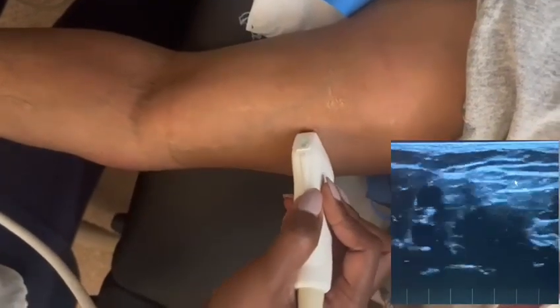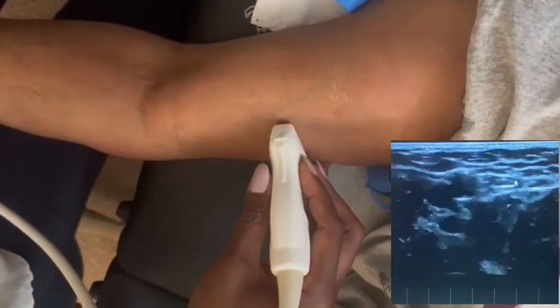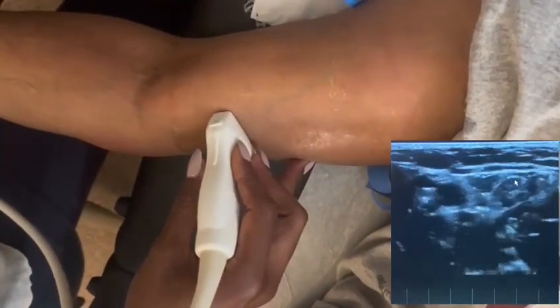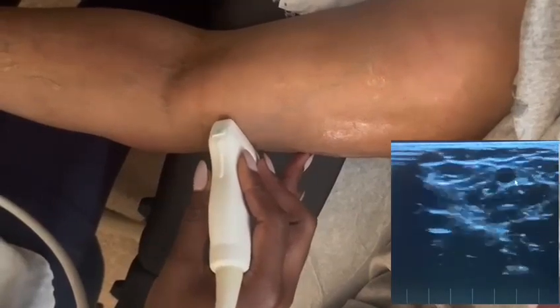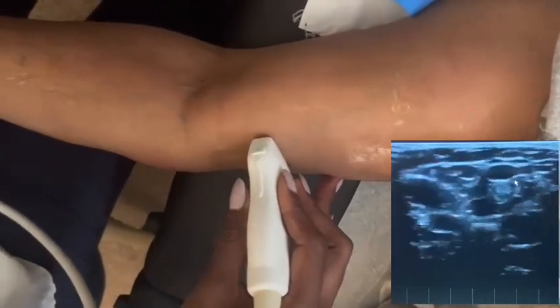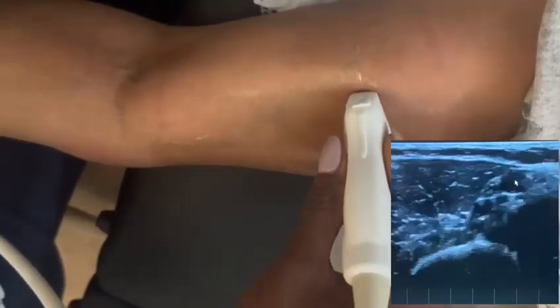You can see the basilic vein taking off — I can tell it's the basilic vein because it's going off on its own with no artery attached to it. I'm following that basilic vein; you can see it right at the fossa where it splits into two. You can keep following it as far as you want if you're doing an upper extremity vein mapping.